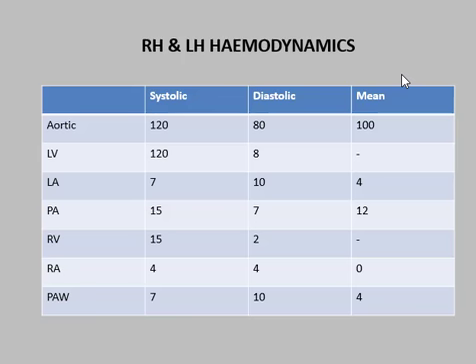Right and left heart hemodynamics. These are the pressures we measure, and you can see we're recording left heart and right heart pressures. Left atrium is, of course, a systemic value, so it's lumped in with the aorta and left ventricle.